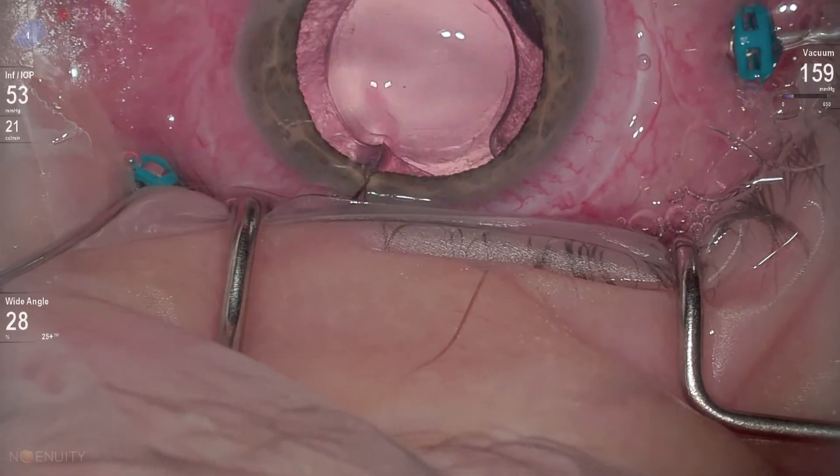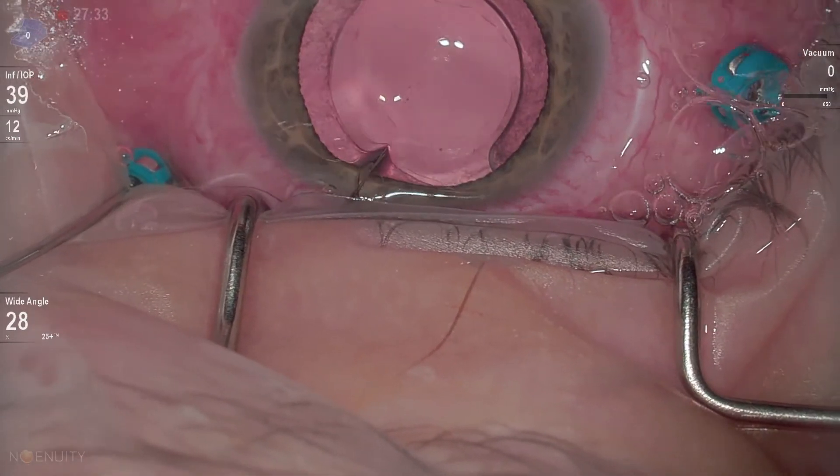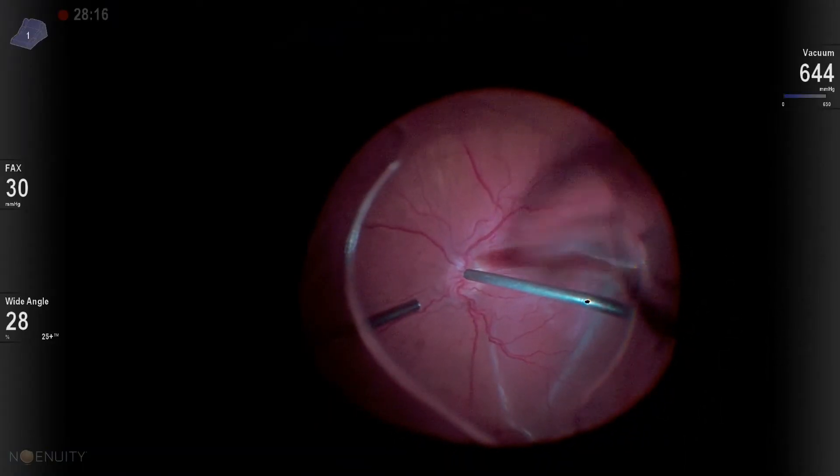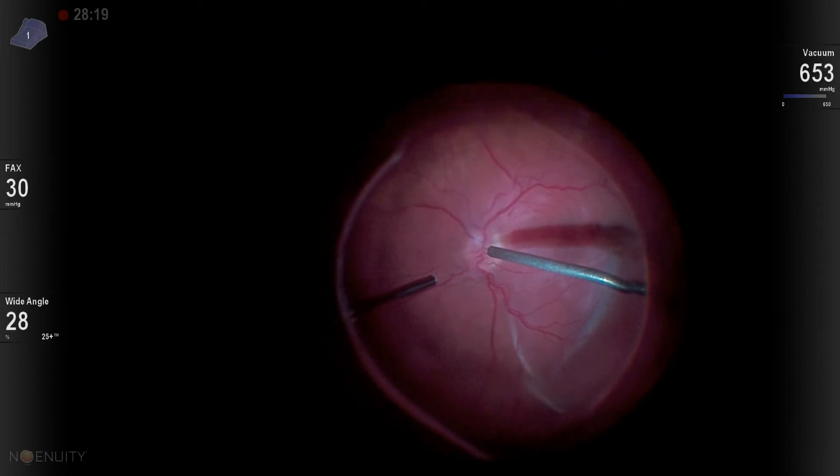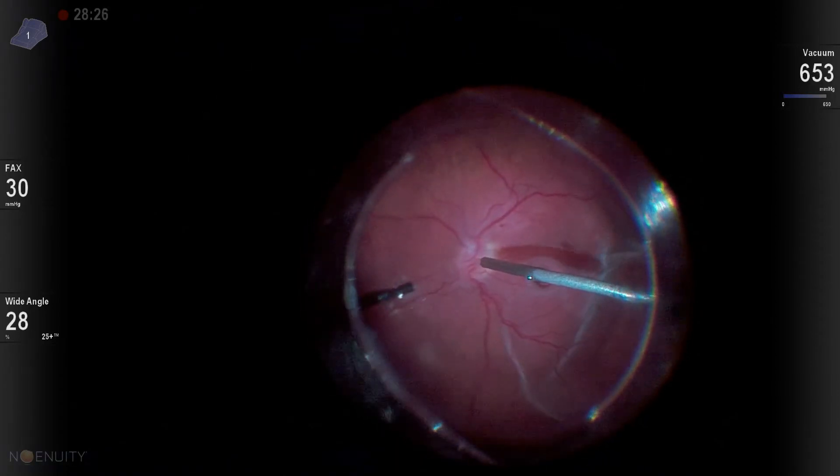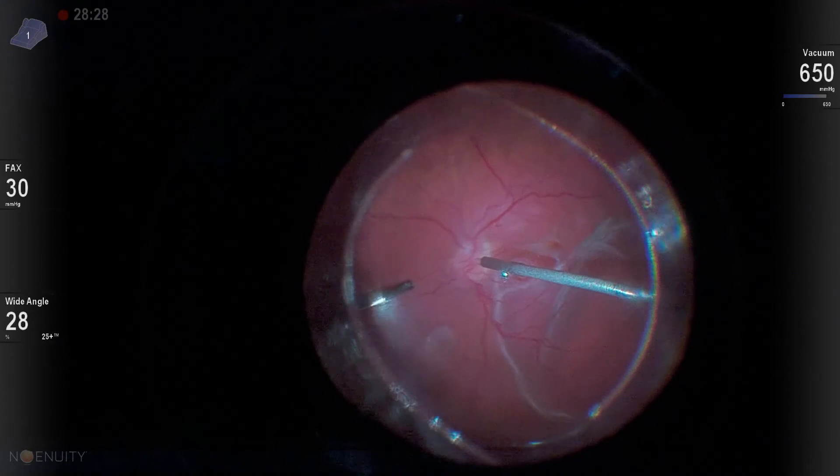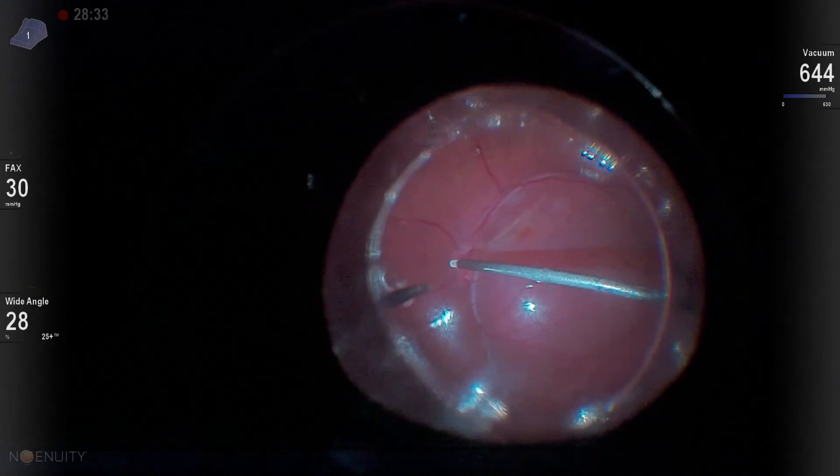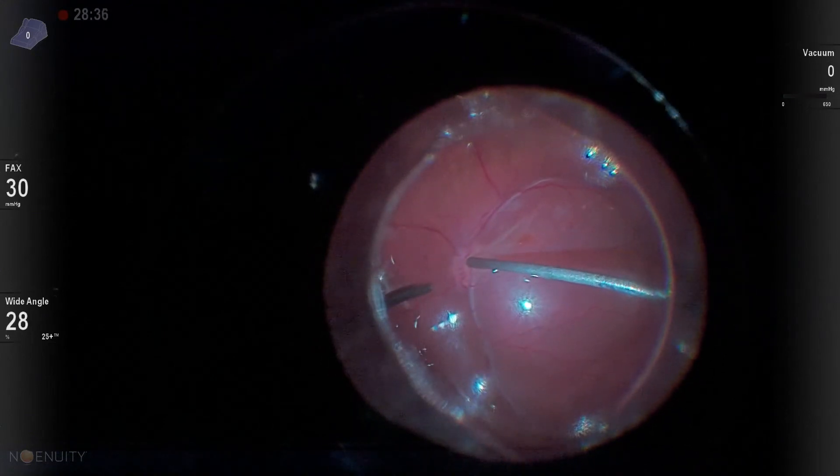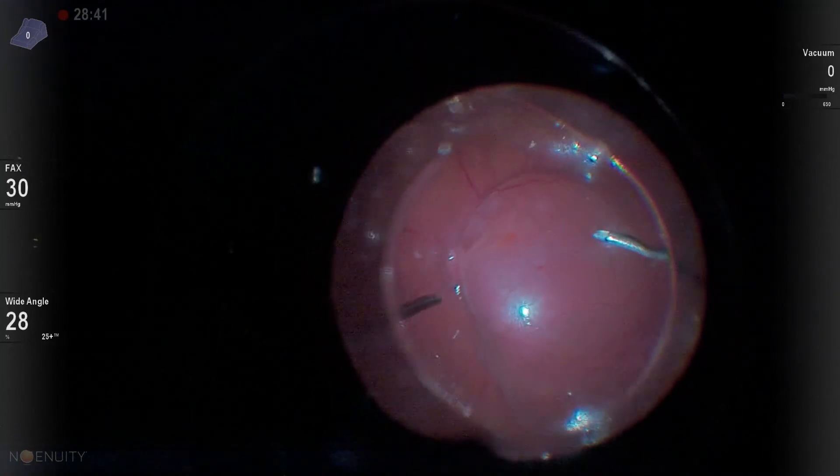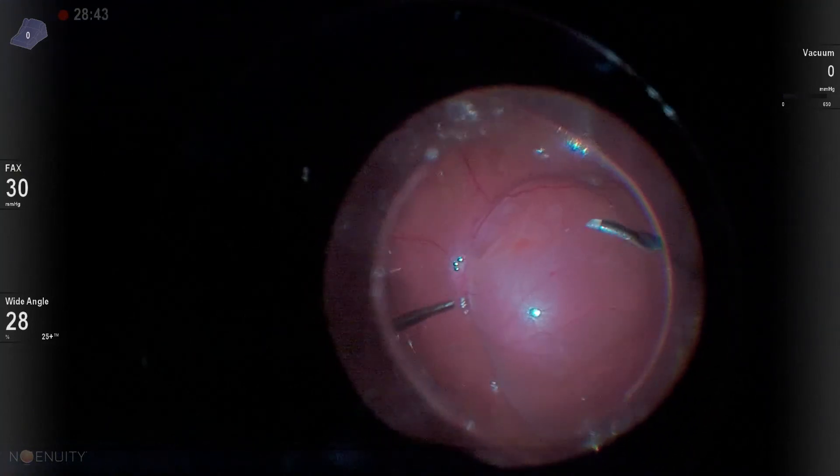Here we can see we're going back to the fluid for the first time. And then what we'll do is we will re-inject PFO. And so it's just kind of back and forth between PFO in the eye to push the fluid out and then air in the eye to encourage the fluid to move more posteriorly, just working to try and stretch the retina and unfold the macula. And here you can now see the fluid goes directly underneath the macula and it's really stretching out that macula quite nicely. And this is what we had hoped to accomplish with our initial injection.